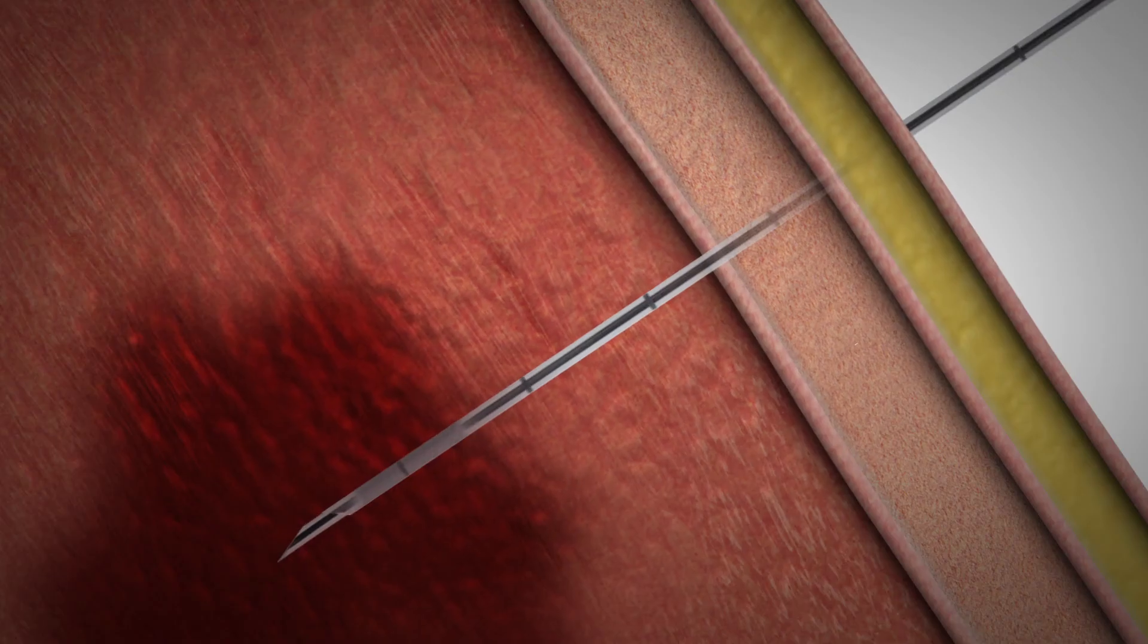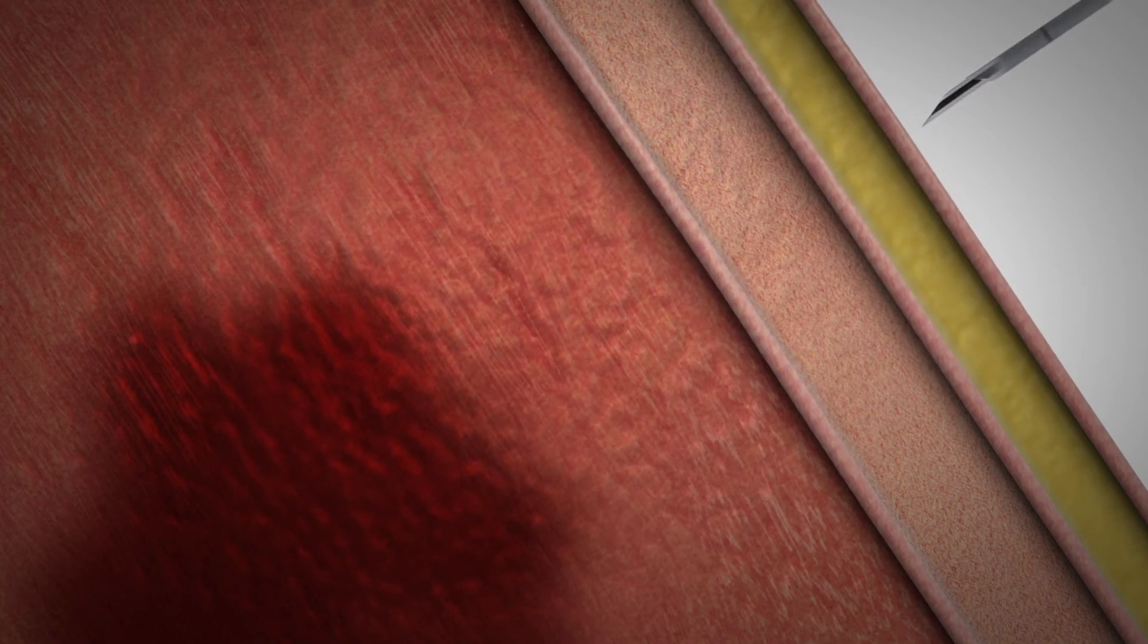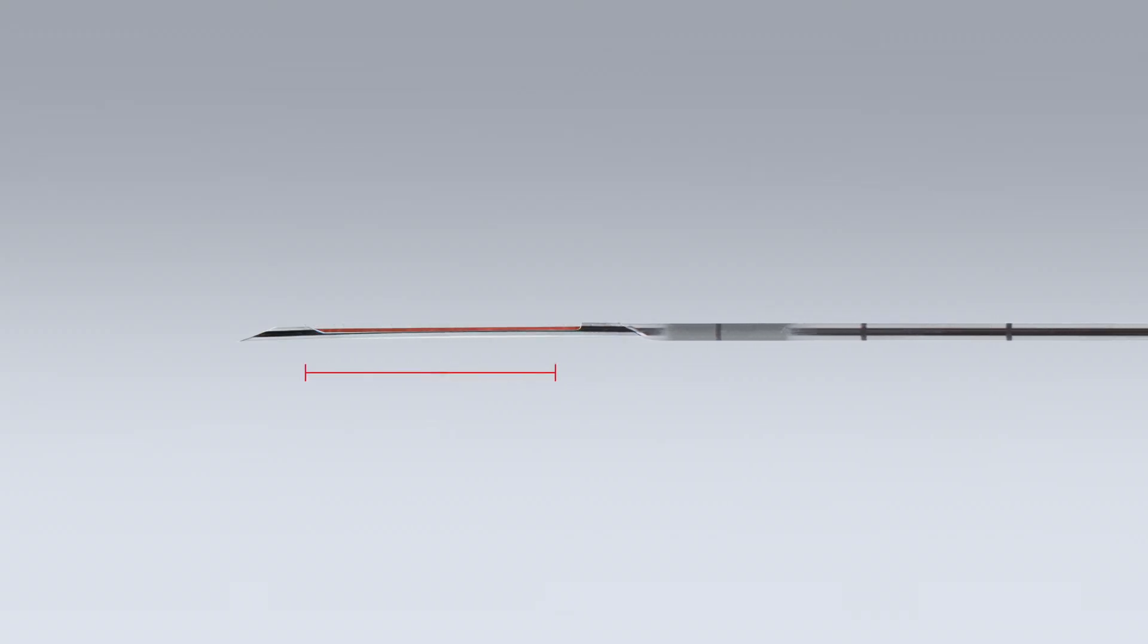Extract MedOne gently out of the patient and pull back the loading lever once to withdraw the cannula and expose sample specimen.